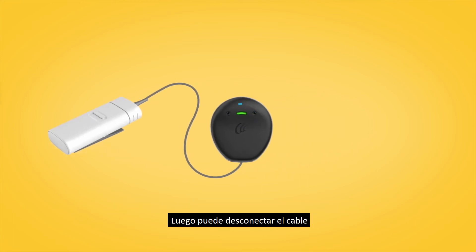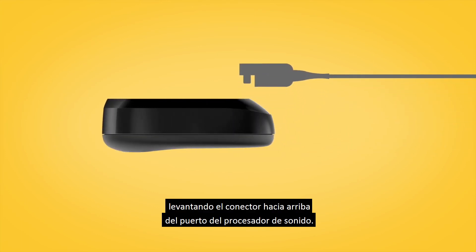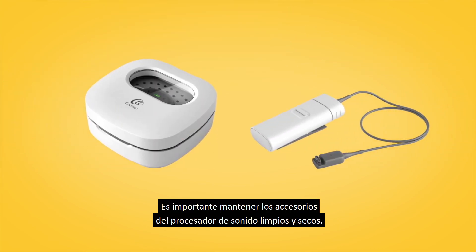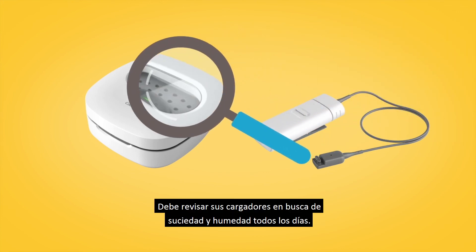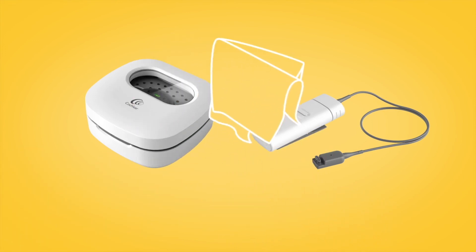You can then disconnect the cable by lifting the connector upwards from the sound processor socket. It is important to keep your sound processor accessories clean and dry. You should check your chargers for dirt and moisture every day and wipe them with a soft dry cloth.